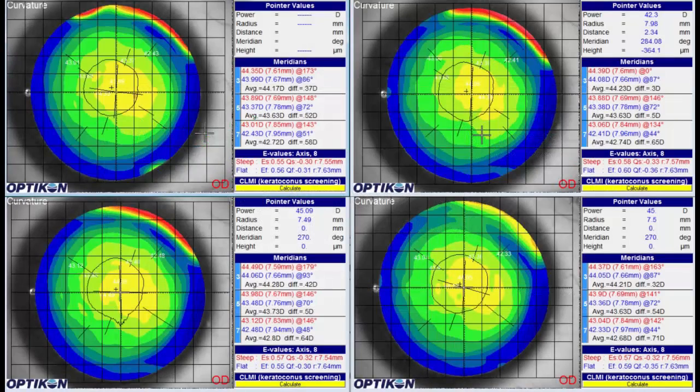In this segment, I'll go over how I determine which map to use for the patient's lens design. I always capture anywhere between 4 and 8 maps per eye and run a repeatability check to make sure that all the data I got is consistent.